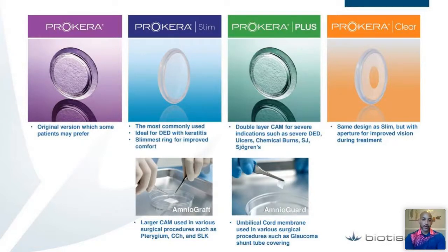I'll just touch on the bottom two. It's the same thing as the top. It's the cryopreserved amniotic membrane, except it's not in a ring. These are mostly used for surgical procedures, both the amniotic membrane, which is the AmnioGraft product on the bottom left, and on the bottom right is the umbilical cord product, also used in surgery. It's used by ophthalmologists as well as a lot of oculoplastics use AmnioGuard as well.